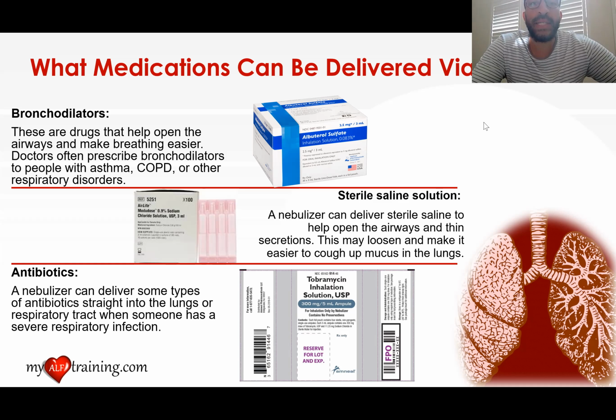Now, another medication that's very commonly given through a nebulizer, second to albuterol and bronchodilators, would be saline, simple sterile saline. I have seen this medication used numerous times, and it's used specifically to break up and loosen mucus that's trapped inside the lungs. I've seen it used almost daily when I worked in the ICU. I'd be caring for patients on a ventilator or patients who are really struggling to breathe and require a lot of suctioning. So, patients that have a lot of mucus.